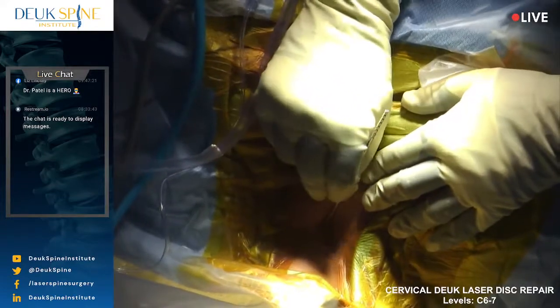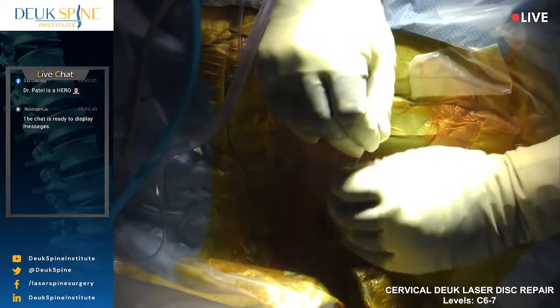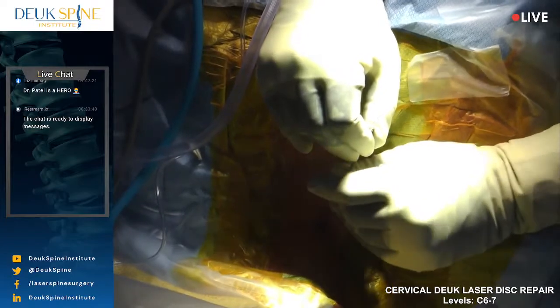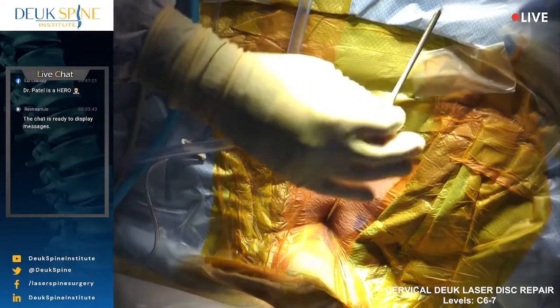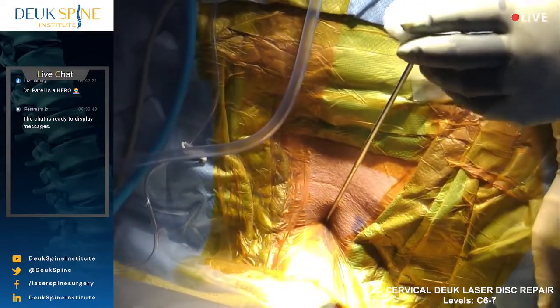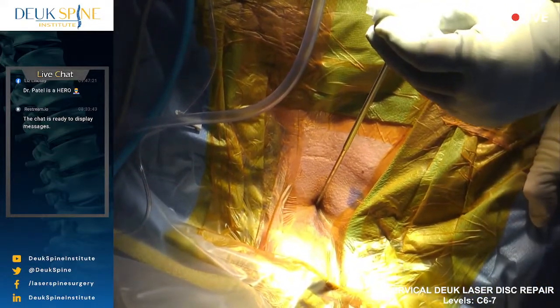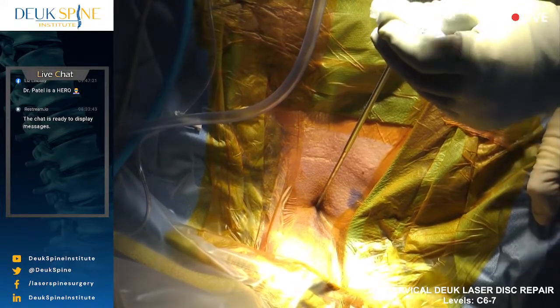All right, I'm just bringing the tube down now over the dilator. I will need you back down at some point, and I'm on front of the spine. So I'll need a shoulder pull, I'll manage all of this, and I'll need a head pull, inline traction. I just need a shot. That's it right there? All right.